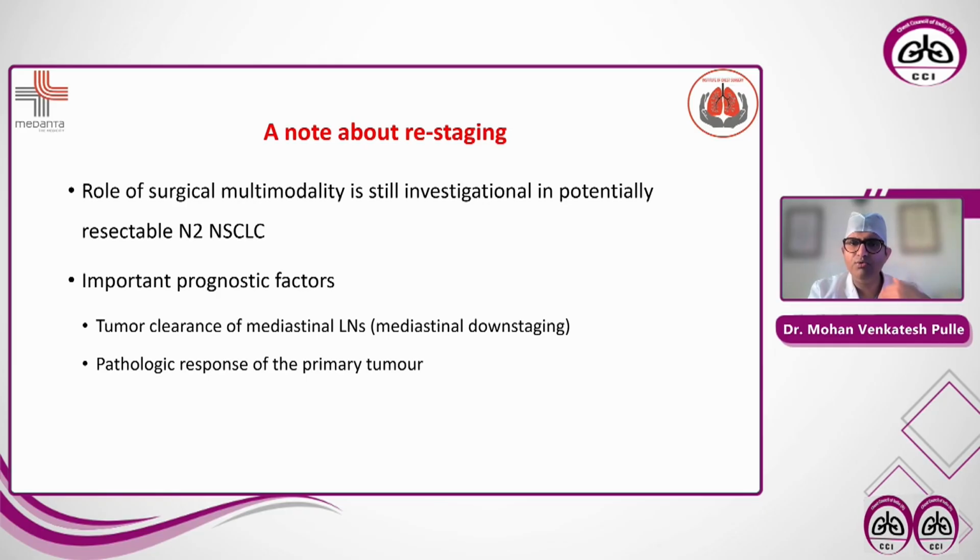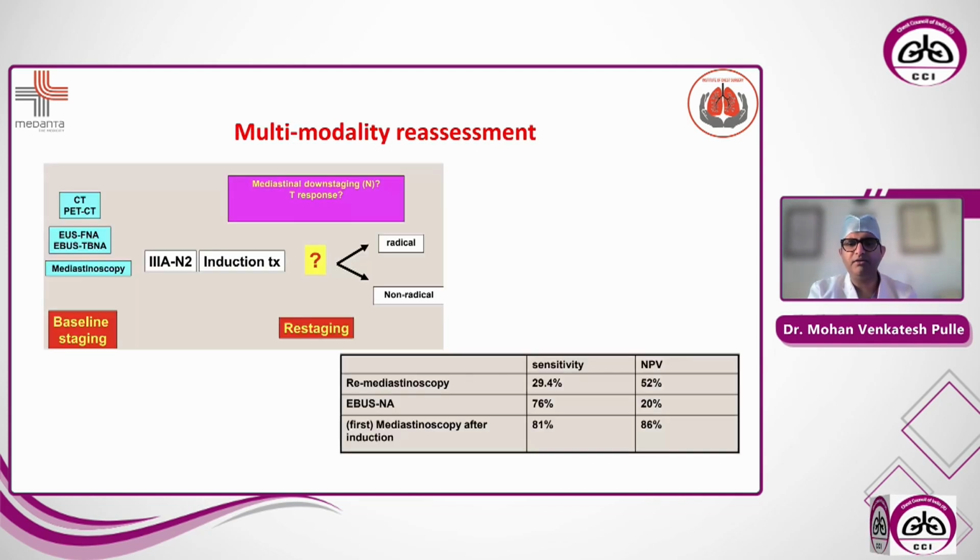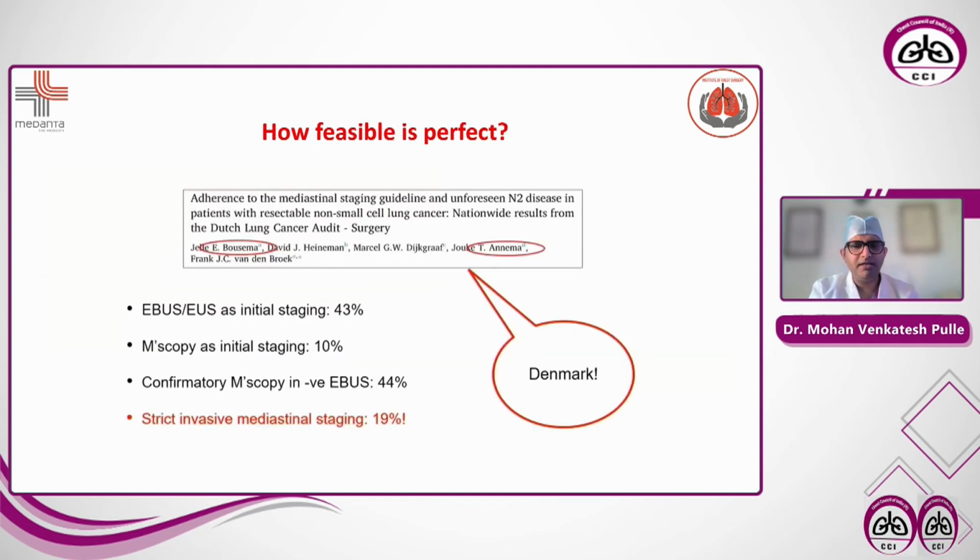In those situations, if you do an EBUS, the sensitivity of the EBUS post neoadjuvant therapy is less. So in those situations, the surgical mediastinal staging fares better. But sometimes, even in the best of situations, all the techniques and recommendations that we are talking about may not be possible in all scenarios.